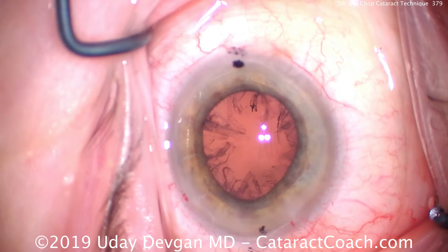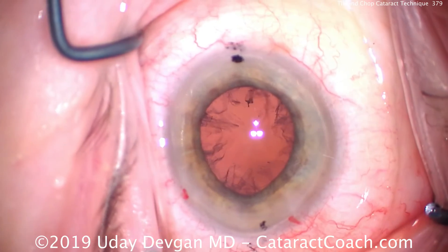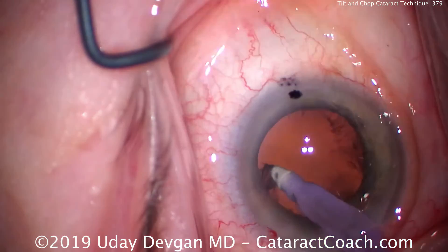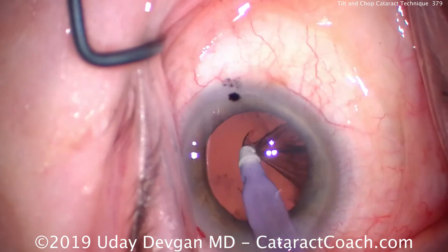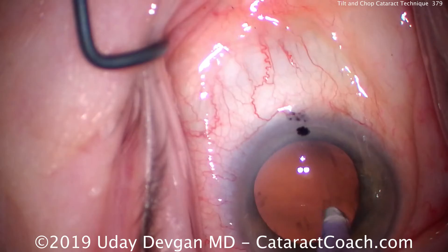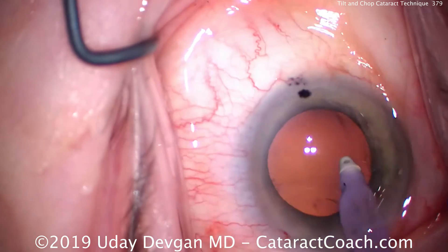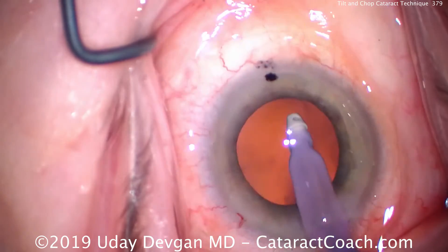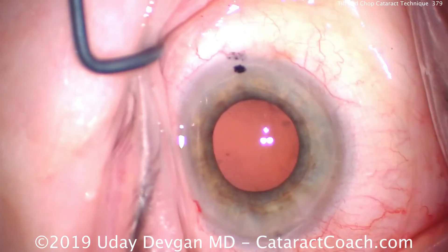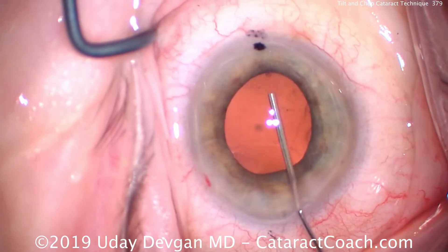That's the end of the technique. I'm going to show you the rest of the case because I want to prove to you that the capsulorrhexis is very appropriate in size — this is not an overly large rhexis. We'll do the cortex removal and put the lens in the eye. This patient is a little bit hyperopic — it's a 25 diopter lens — and the anterior chamber is a little on the shallower side. But even then, we're not flipping the whole nucleus out of the capsular bag; we only tilted up one edge of it. You only need to have one edge of the nucleus slightly out of the capsular bag to expose that lens equator. Then the phaco probe goes on the anterior part and the chopper goes around back to the posterior side, and the two instruments are brought together and the nucleus is chopped.